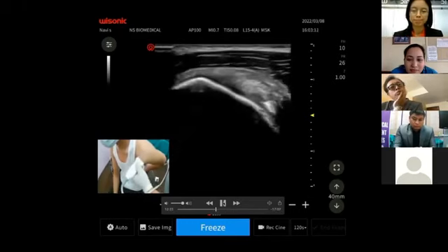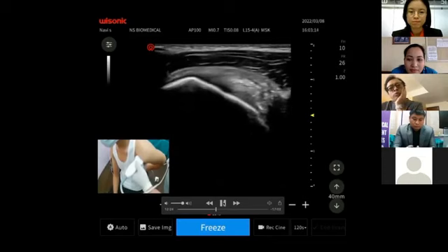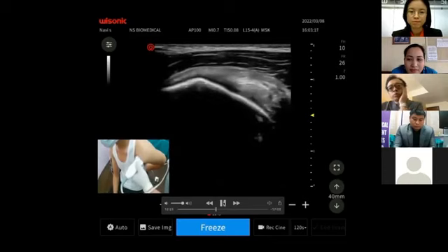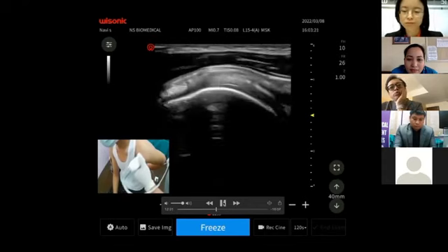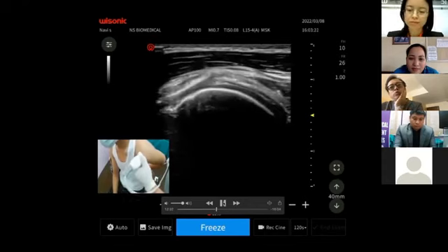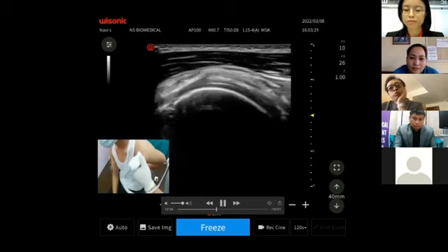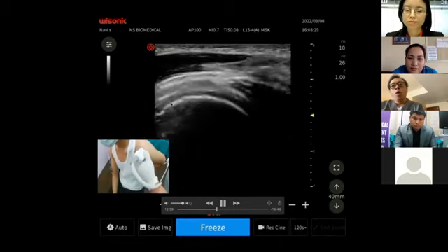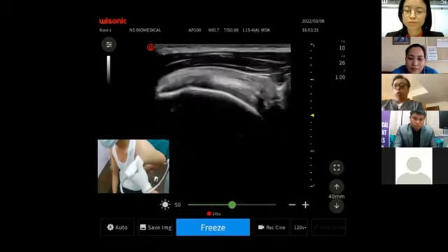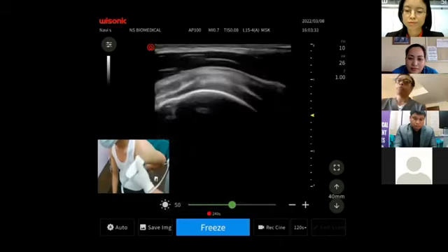So when we are anterior and the greater tuberosity is pointed like that, we know that we are looking at the supraspinatus tendon. As we scan posteriorly, when the greater tuberosity becomes rounded, we know that we're looking at the infraspinatus tendon fibers. You can scan it all the way posteriorly to see its insertion and see whether the tendons are normal or pathological.